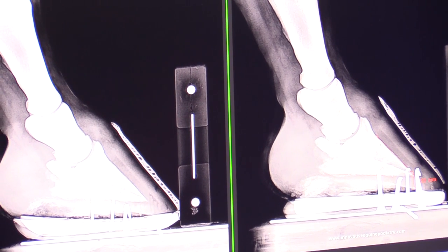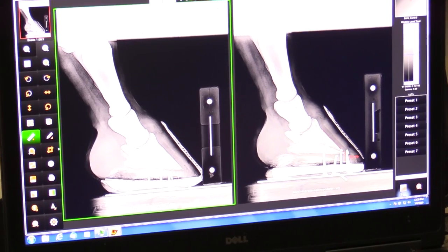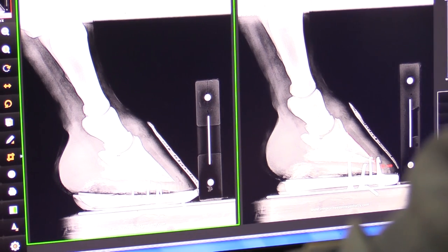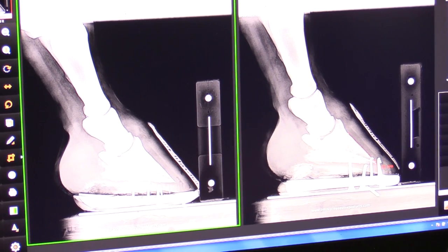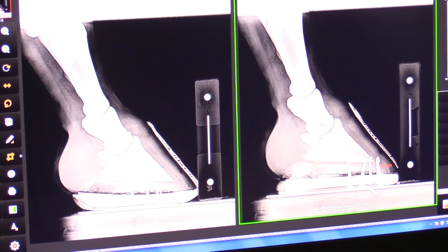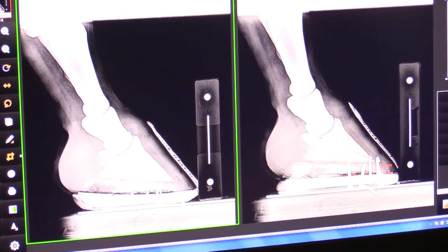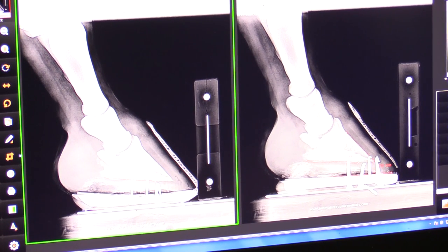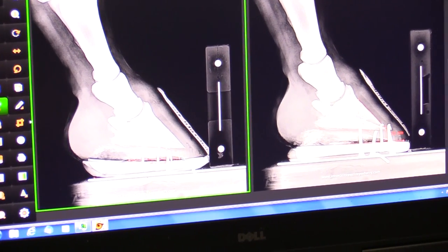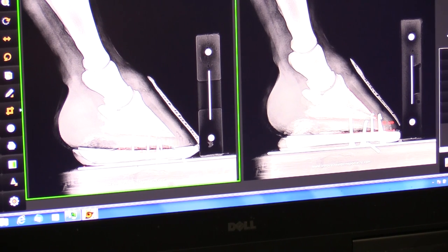So when we're considering that, this little marker that we put in the plane of interest will automatically correct for that magnification. And I like it because it's a way for me to be somewhat consistent in comparing radiograph to radiograph. Run through here and take a couple of measurements. So the palmar angle in this horse changed from 5.3 to 7, just a couple degrees change. Probably the most significant thing is that toe lever that's working against us.